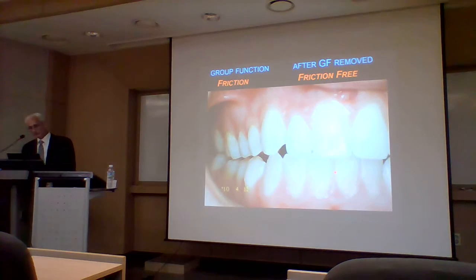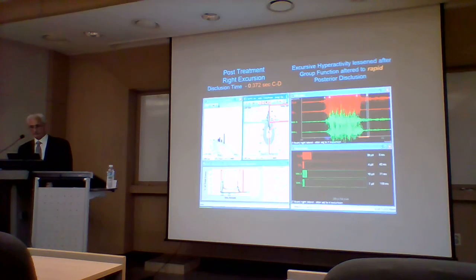So then, when we remeasure her, she's sliding to the right again. It appears that she discludes visually. And then, we look at her T-scan EMGs. So here you see the center of force travels to the anterior teeth, and the red quadrant takes over instantaneously.